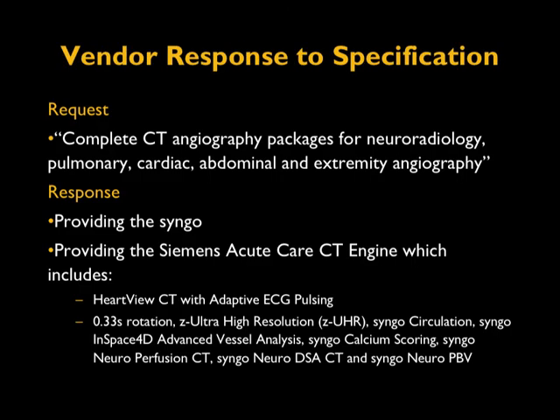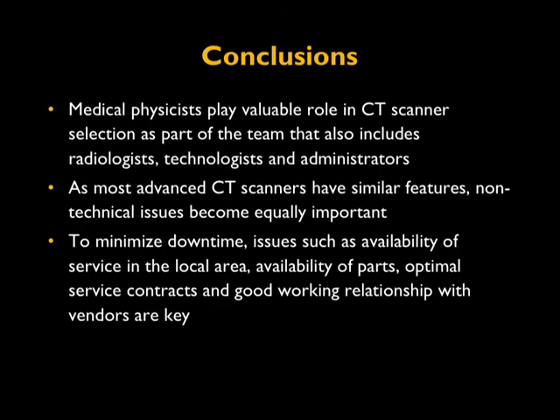This is another request for a high-end scanner asking for a complete CT angiography package. What is the availability in the scanner? And the response from one particular manufacturer provides all the details, such as what packages they have. So in conclusion, the process is lengthy, but when done in a team environment, one can have a choice of picking the best scanner that fits the requirement.